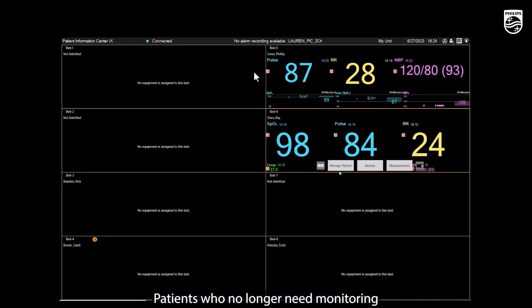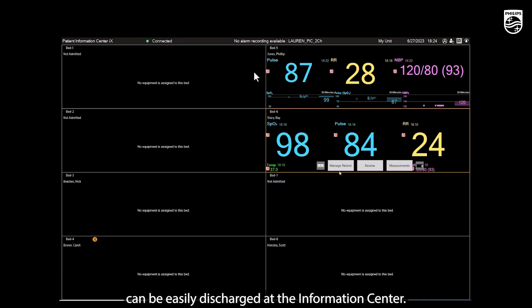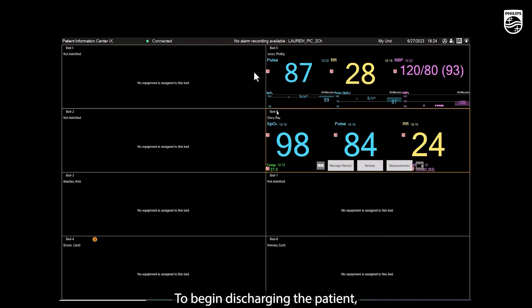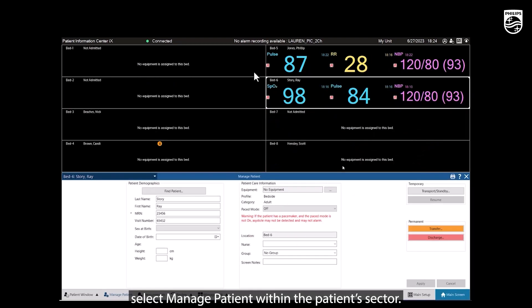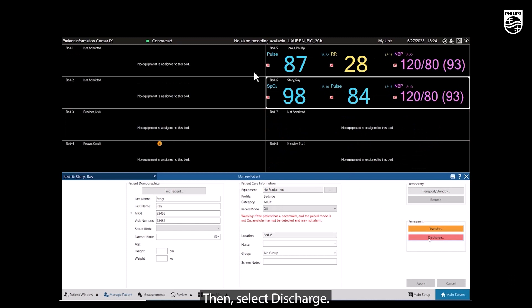Patients who no longer need monitoring can be easily discharged at the Information Center. To begin discharging the patient, select Manage Patient within the patient's sector, then select Discharge.